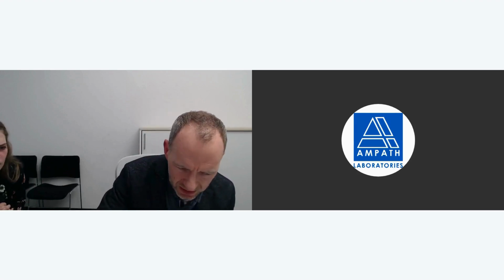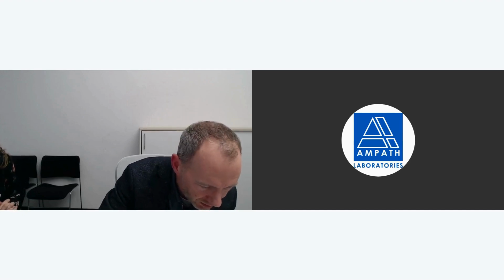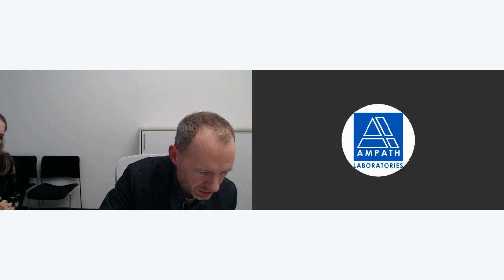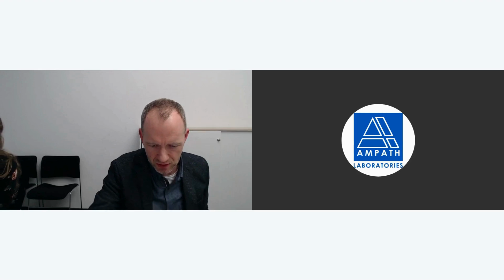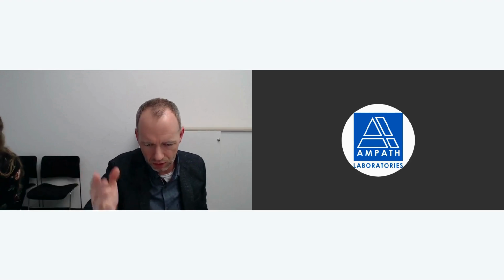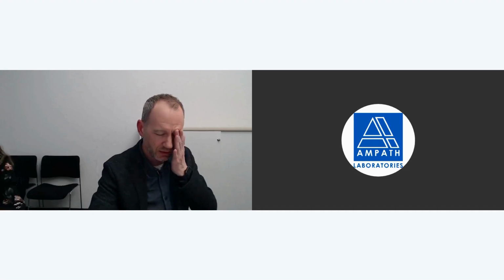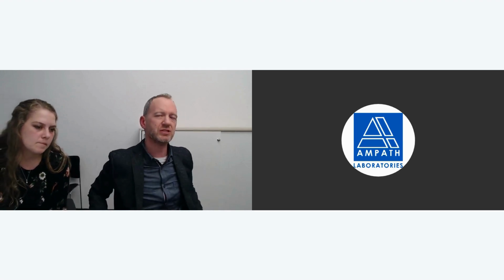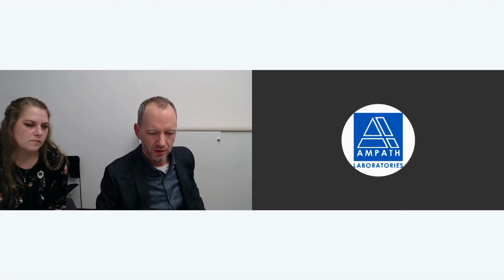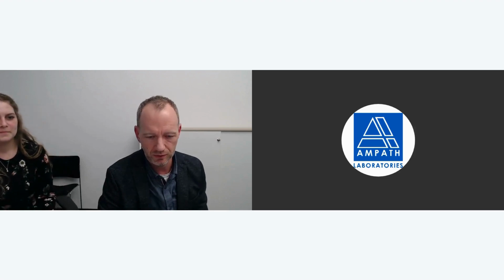So the alpha-gal is added onto the ALEX3. There was a slide. I can tell you which slide. Slide 22. It's all about the alpha-gal that's been added, and it's featured on the second row on the right-hand side of the test. We appreciate, as we said, that this is an allergen, or a syndrome, of growing importance. That was communicated to us, and that's why we decided to include it onto the chip.